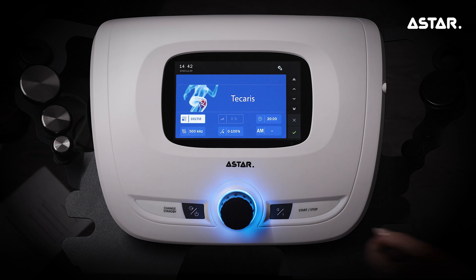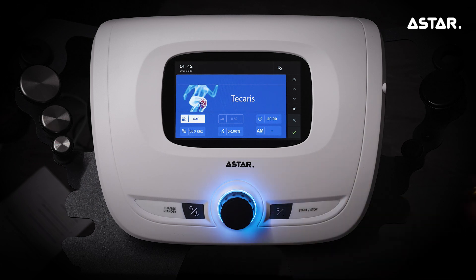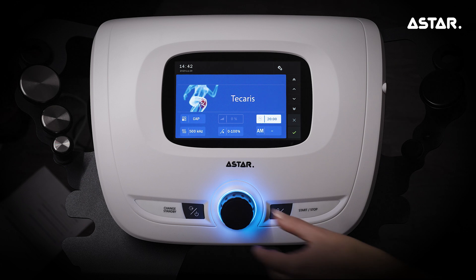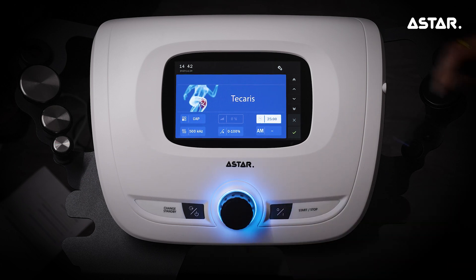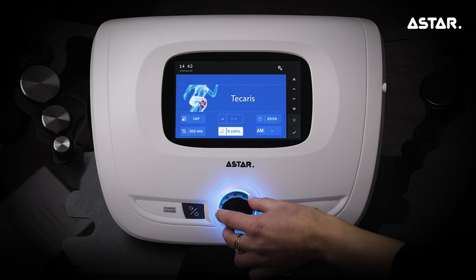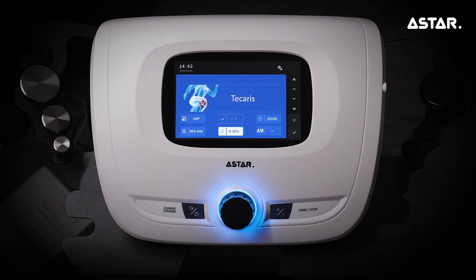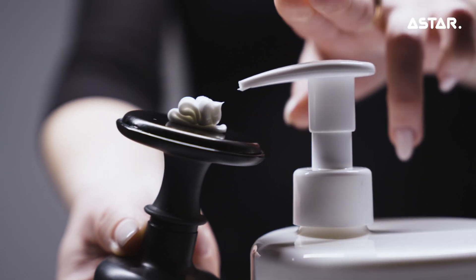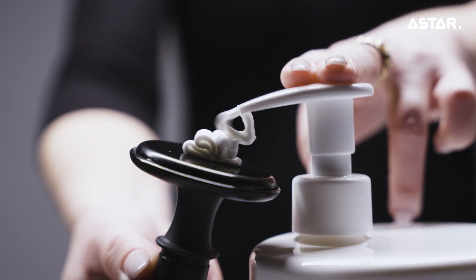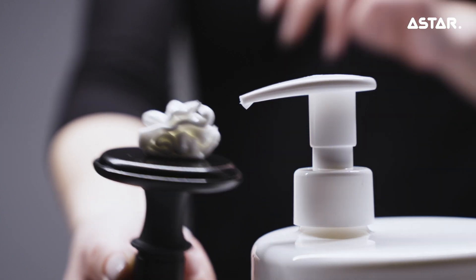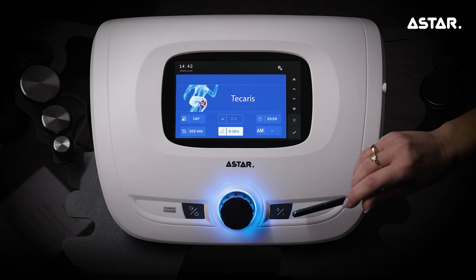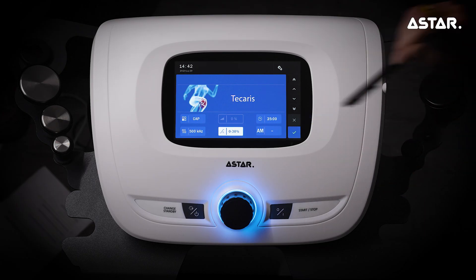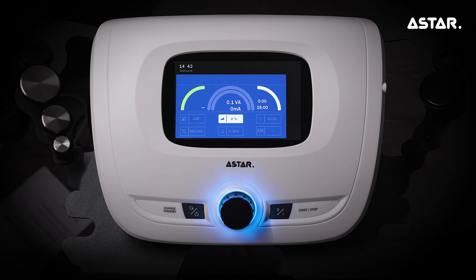Select CAP mode (Capacitive) and set other treatment parameters. Remember to apply the right amount of RF cream. Start the treatment by pressing the start-stop key or the confirmation button on the touch screen.